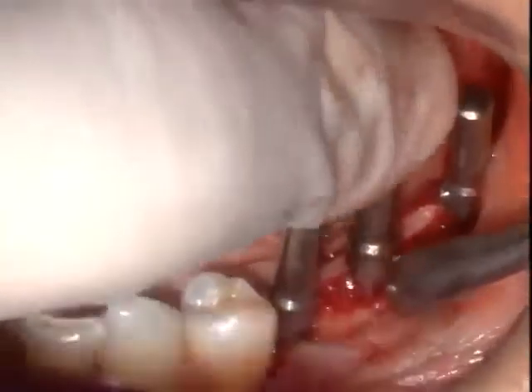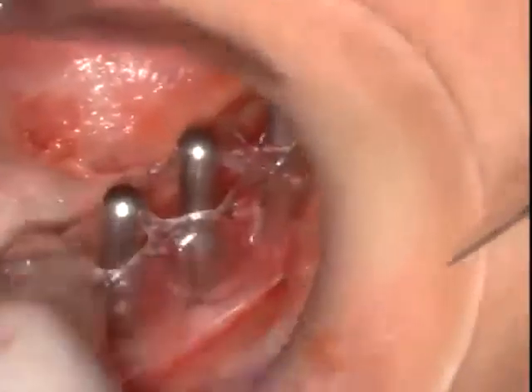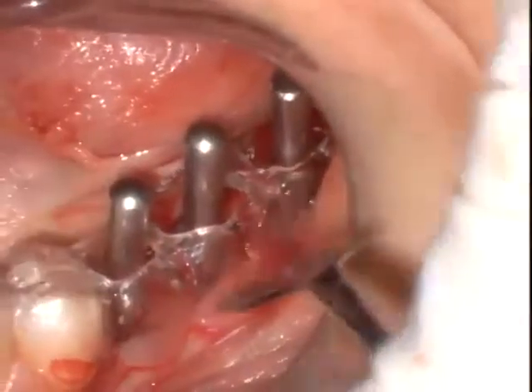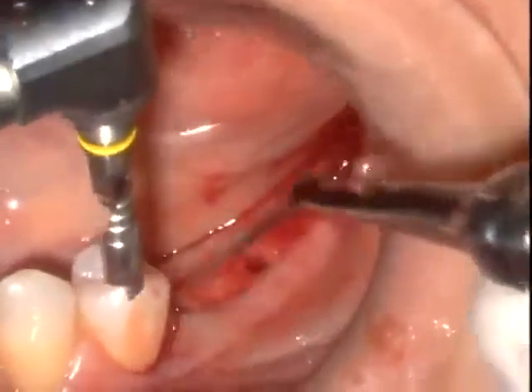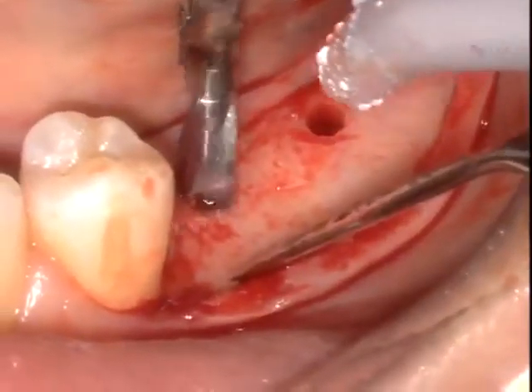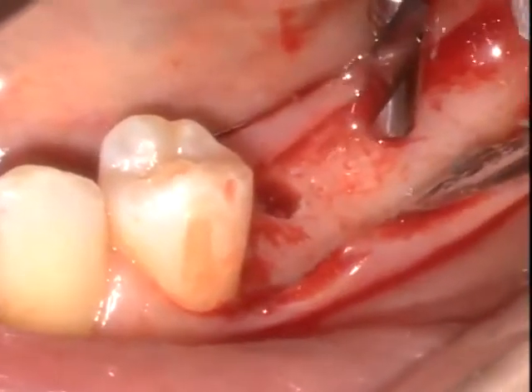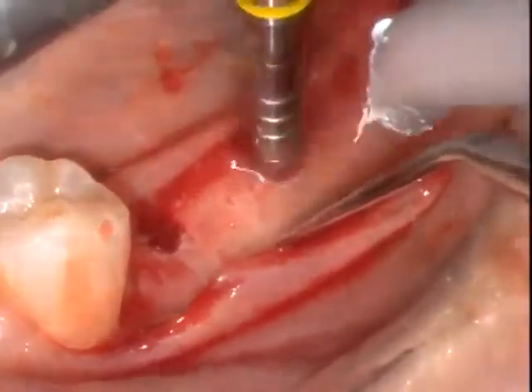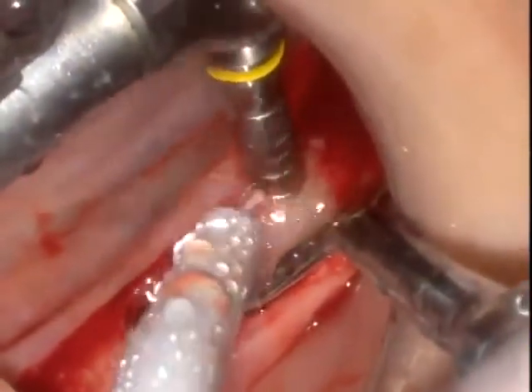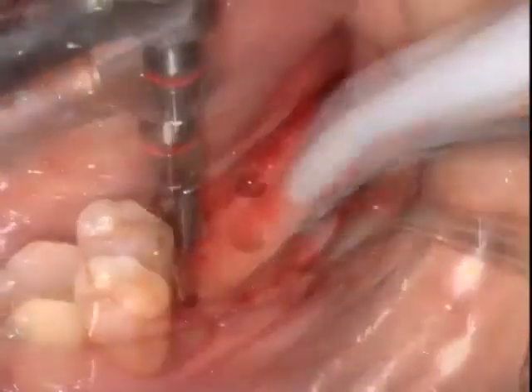Direction indicators are then inserted, and immediately after the 2 millimeter twist drill, we want to verify the accuracy of our initial drilling. So again, the duplicate of the surgical guide is inserted. This is also going to facilitate immediate temporization. And we initiate and begin enlarging the osteotomy sites for the appropriate dimensions of the implants to be inserted. The 3 millimeter twists are utilized in succession, and every attempt is made to keep the drills parallel as they are inserted.